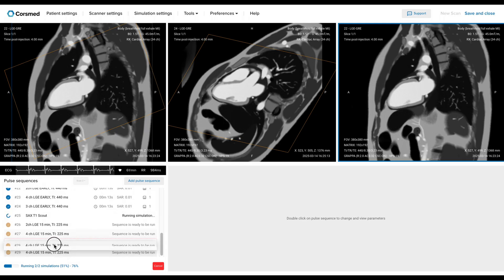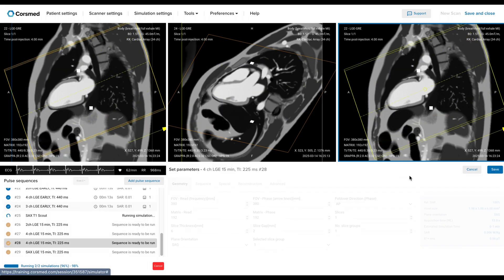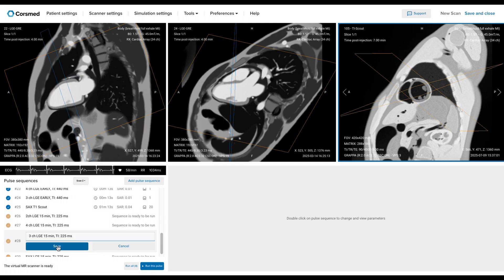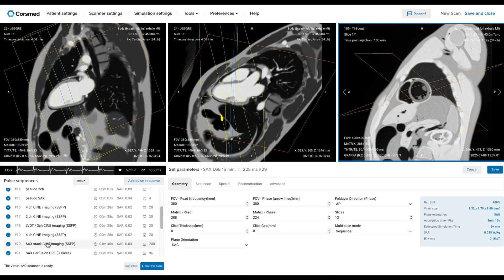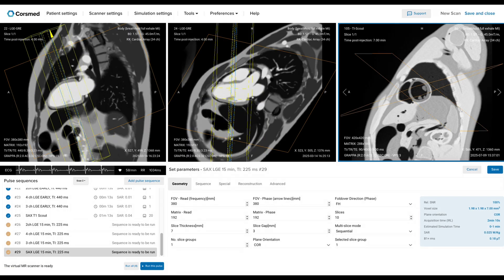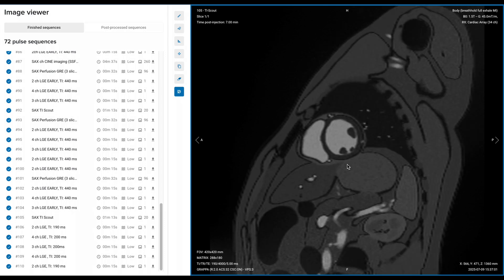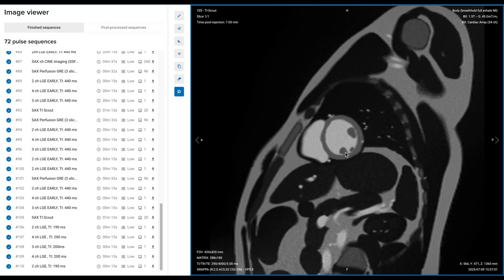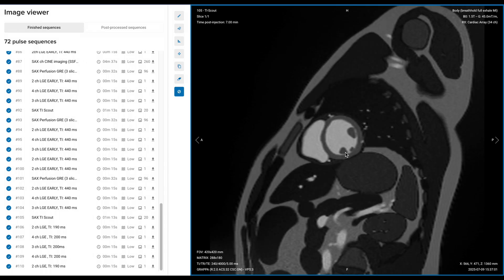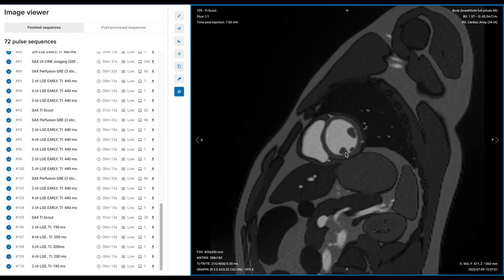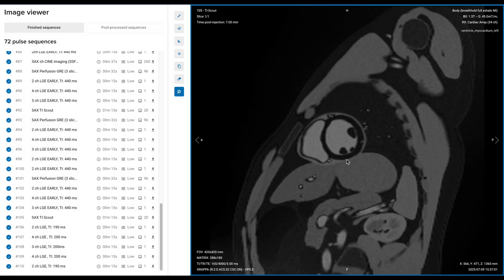Let's copy the slice position for our short axis as well. Now let's look at our TI scout in the image viewer, where we have better tools for visualizing it. Let's scroll through the images to find the right view. We want to watch where the myocardium interfaces with the blood pool, and also where the papillary muscles and the epicardium cross over. While scrolling, we can see the myocardium starts to get black and then goes back to being light. We want a view that lets us see the epicardium as well — it should be bright, or at least a little brighter, but not too much.